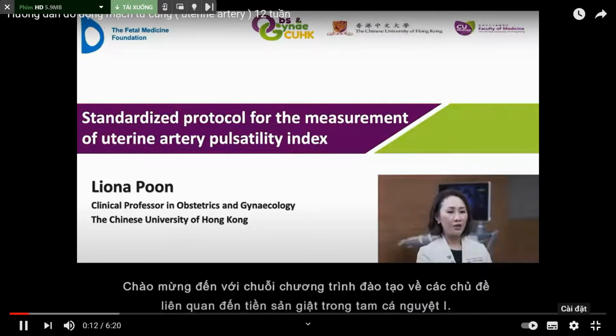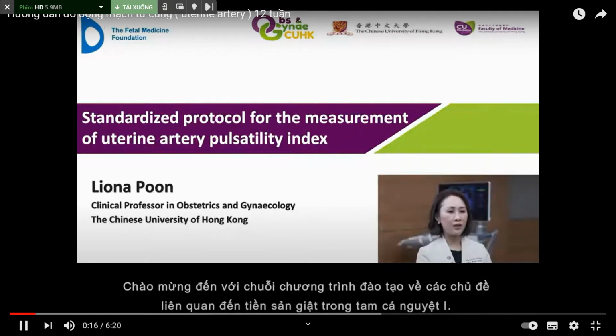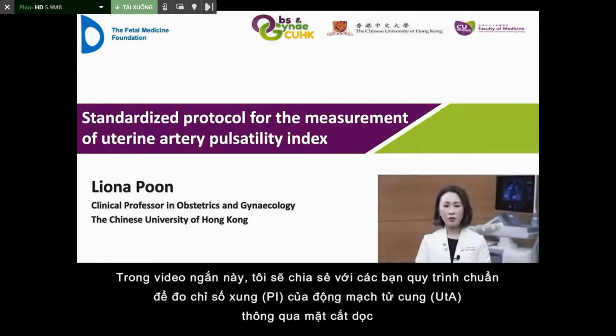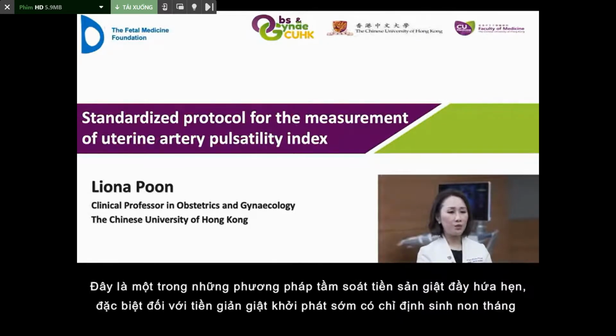Welcome to our educational series on the various components of the first trimester preeclampsia screening program. In this short video, I will share with you the standardized protocol using the sagittal approach for the measurement of uterine artery pulsatility index, which is one of the most promising screening tests for preeclampsia, especially for early onset preeclampsia requiring preterm delivery.